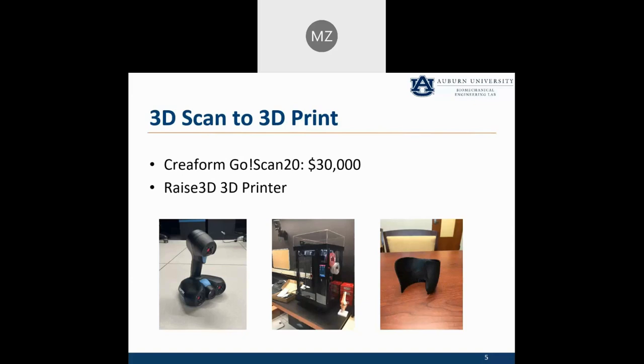And so we were able to provide a perfect 3D scan, with basically micron level accuracy, of his injured hand. And what we did was we took that surface, and we generated a clamshell type cast device that you can see there on the right that fits perfectly up against his hand. And so we got the surface from the 3D scanner. We generated the 3D model in software to make this 3D printed device. We 3D printed it on the printer you see there. And this particular print took a long time. It took probably 15 hours to print. So essentially we had to send Anthony away, and he came back a couple days later, and we were able to fit it on Anthony.